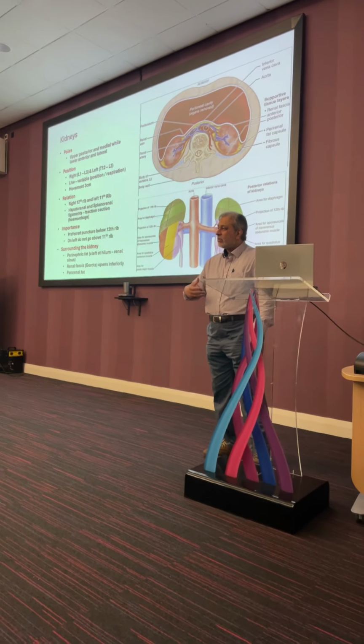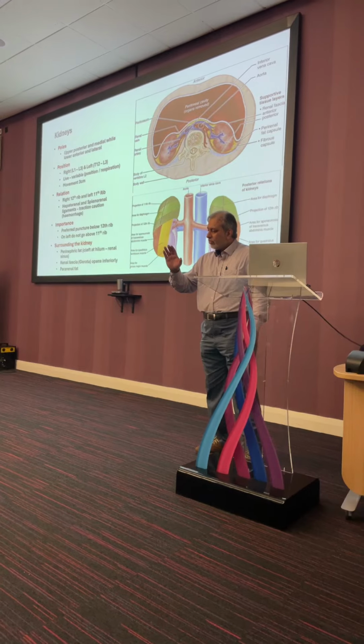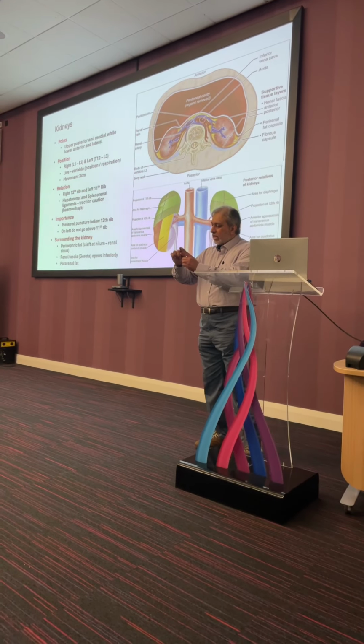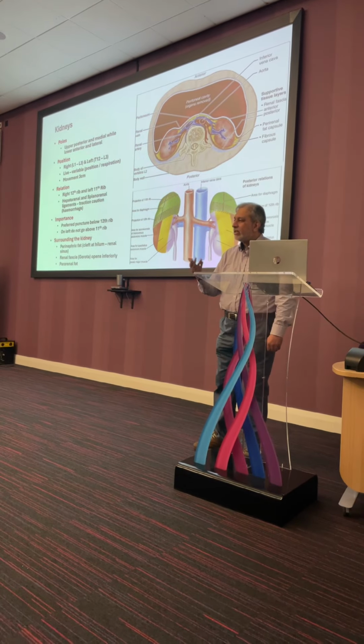Patients who already had surgeries before, or where the kidney mobility is not good, we may distort that fascia and there is a small bleeding. That's what happens. So that's why we need to be careful.